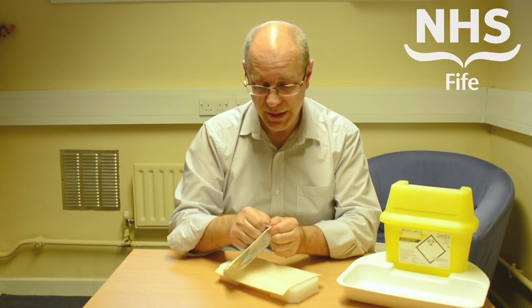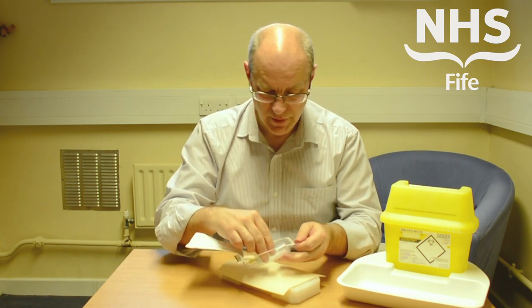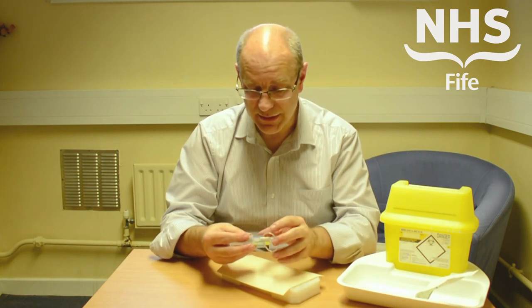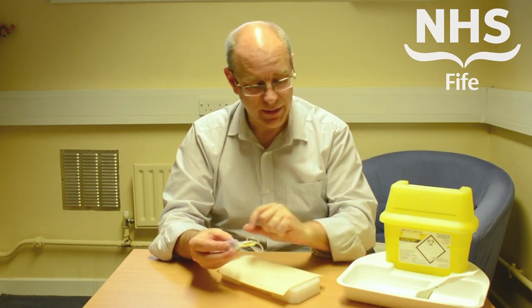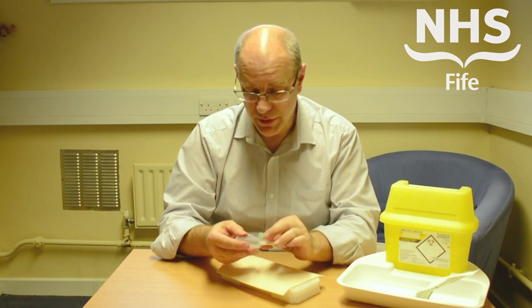To use the device, simply peel open the packet. The device can then be removed. The packaging can go into your normal domestic waste — it doesn't need to go into the sharps bin. This particular product also has a little piece of blue plastic that keeps everything neat in the packet; again, that can be disposed of into your normal domestic waste.